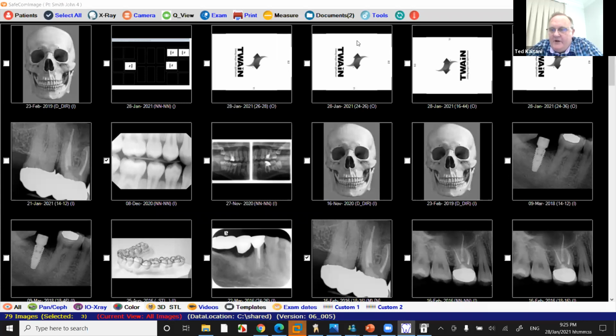If we don't have a bridge, or if the management software company is charging you for the bridge, then we can build an external bridge to that software. All of them do have it, but some have decided lately to charge for bridges so they can make an extra dollar. So in that case, we'll actually build an external bridge so the customer doesn't have to pay that extra money. Oh, wow. That's awesome. Thanks for answering that question.